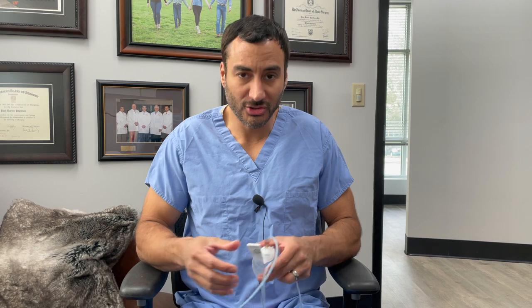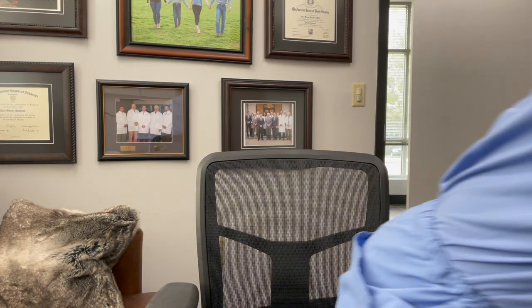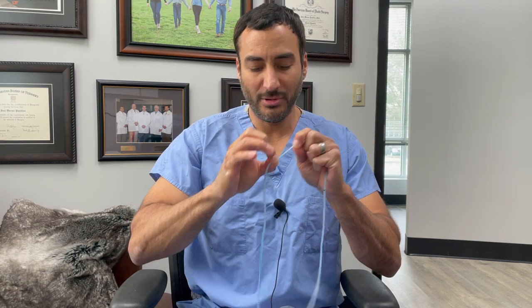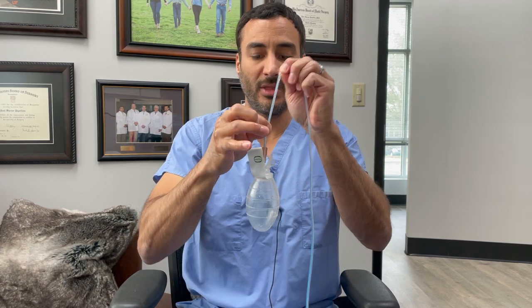Let me show you a better picture of what that looks like up close. I got a little hand sanitizer to make things slippery. I have the tube, and I'm just going to milk it — compressing it with my fingers, holding it stable, and going all the way until it goes into the drain. When you do that, that's going to clear whatever's blocking the drain, and then flow should resume as normal.